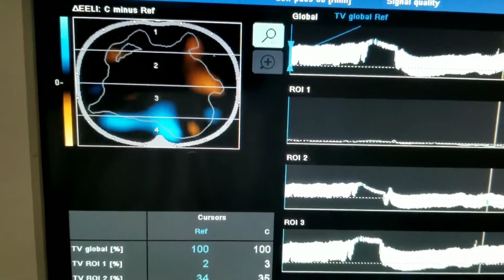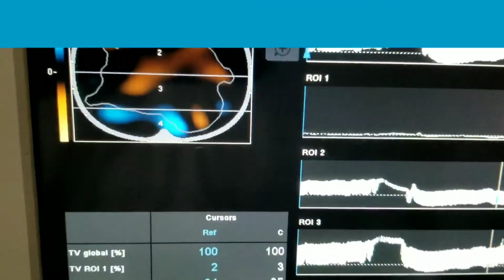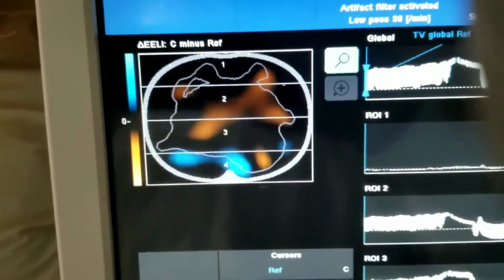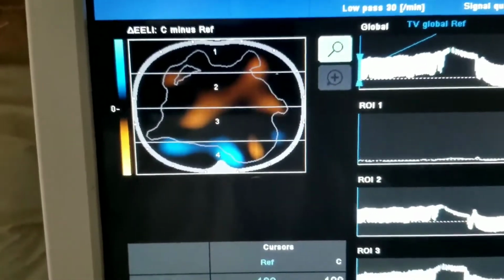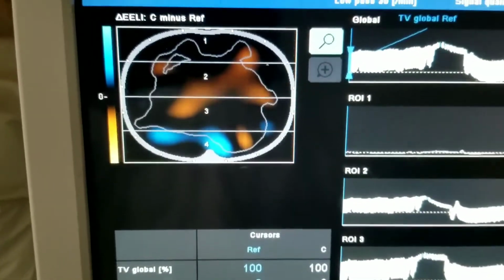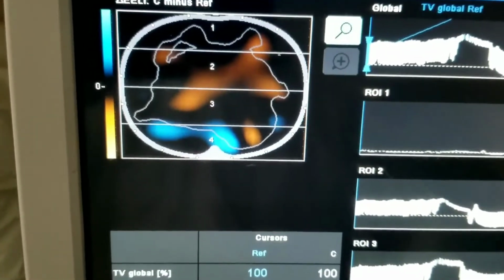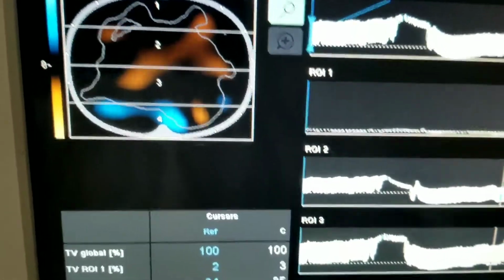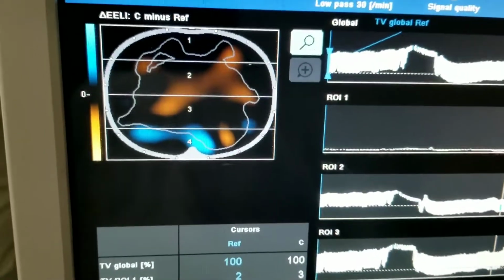Now, over time, and that's what shows it, like how long it takes to recruit. Sometimes we'll do optimal PEEP at the bedside and we're literally letting a minute or two go by. It can take a very long time, understanding that the lung is not homogeneous, it's heterogeneous, and that alveoli have a great variation sometimes in time constants, meaning some of them will increase at different pressures, some of them will open up, some of them will never open up, and some will open up rapidly and some over a long period of time. This could be minutes to hours sometimes.